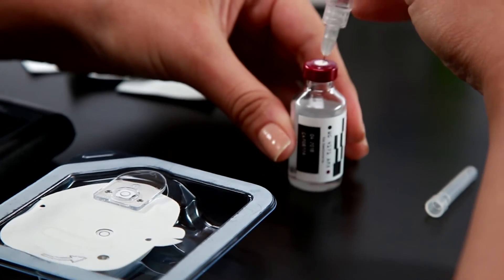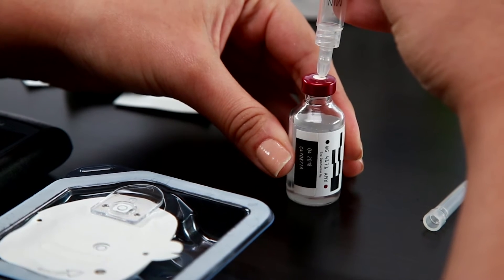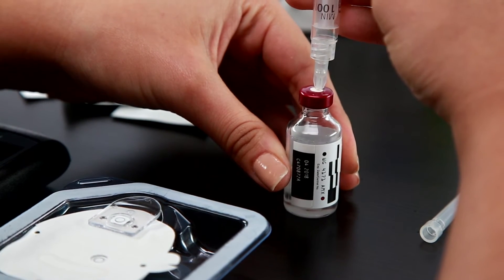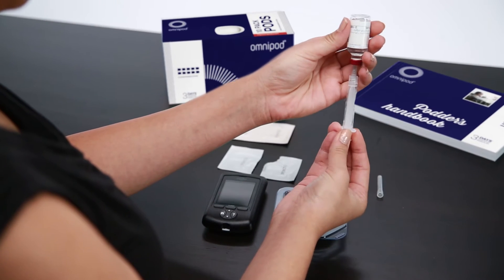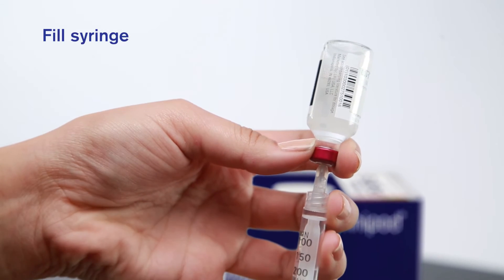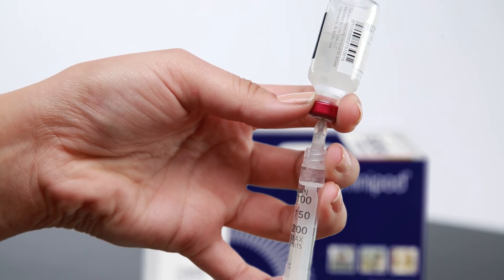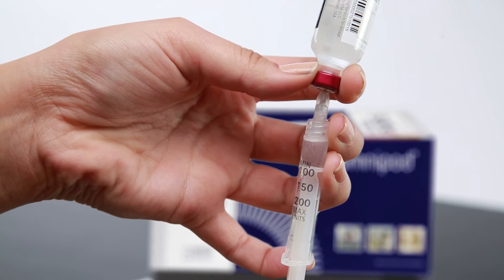Depress the air into the vial of insulin. With the needle still in the vial and your finger still depressed, turn the vial of insulin upside down. Fill the syringe with your needed amount of insulin. Be sure to remove any bubbles from the syringe.